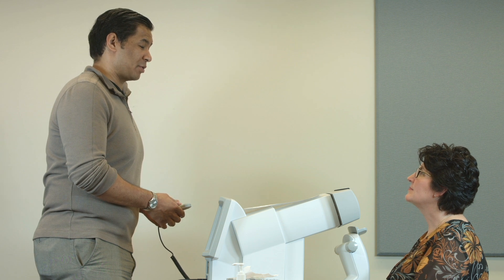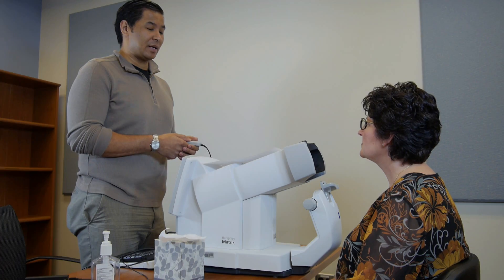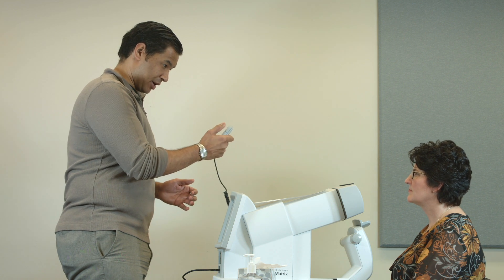At this booth we're going to test how good your side vision is. This is the clicker that you're going to use during the test, and the test takes about two minutes per eye. This machine is going to show you some patterns that flicker or shimmer. Each time you see one of these patterns, just click the clicker button you have in your hand.